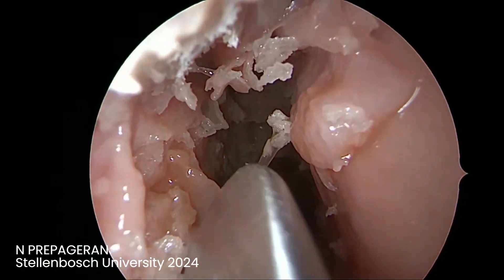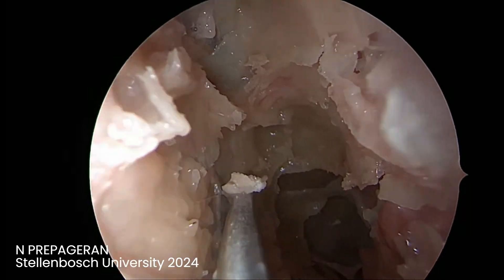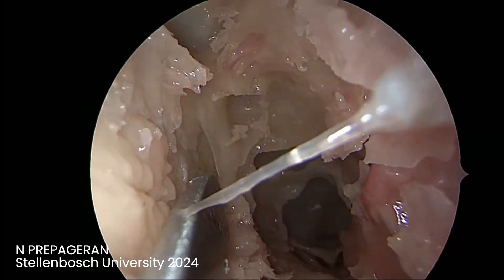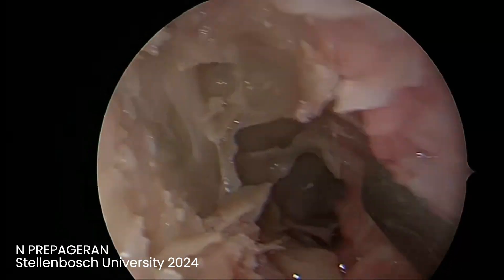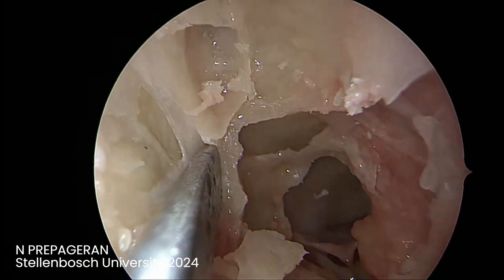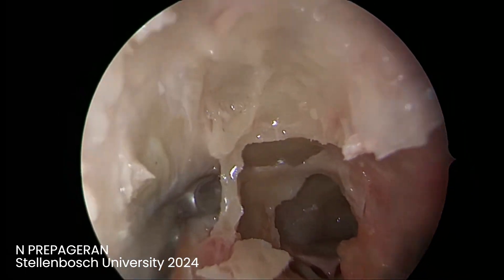I'm going to decompress the orbit. What you need to do is identify the lamina papyracea. Once you go to the lamina papyracea, you just have to open it up. Then we go all the way to the back, moving the bone and following the orbit all the way to the back.